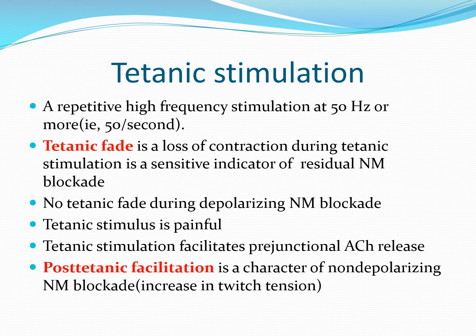Tetanic fade is a loss of contraction during tetanic stimulation. It's a sensitive indicator of residual neuromuscular blockade. It's a character of non-depolarizing muscle relaxant. There is no tetanic fade during depolarizing neuromuscular blockade. Tetanic stimulation is painful, it's not suitable for awake patients.